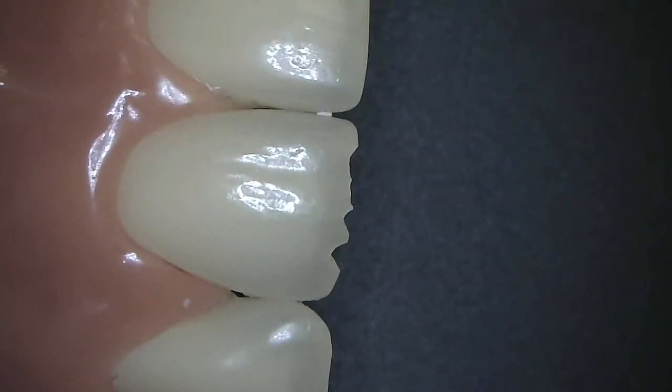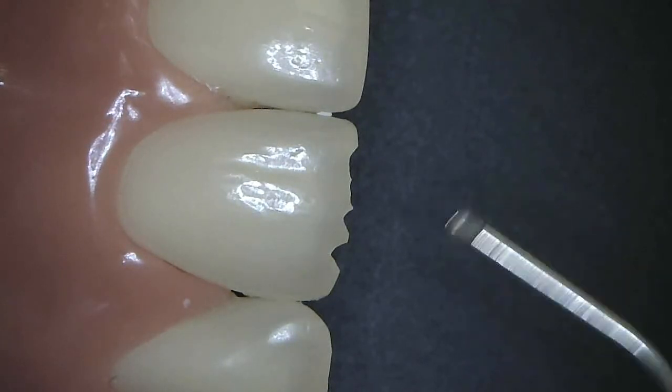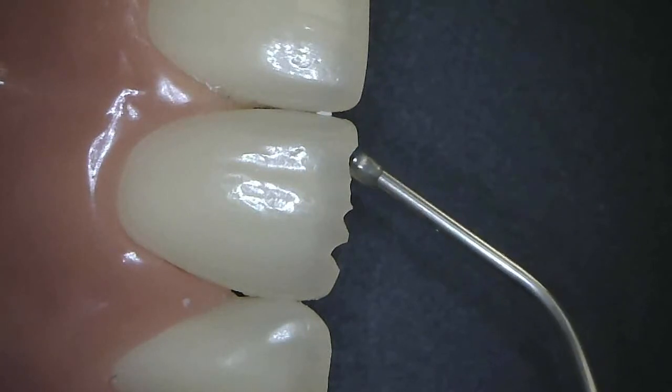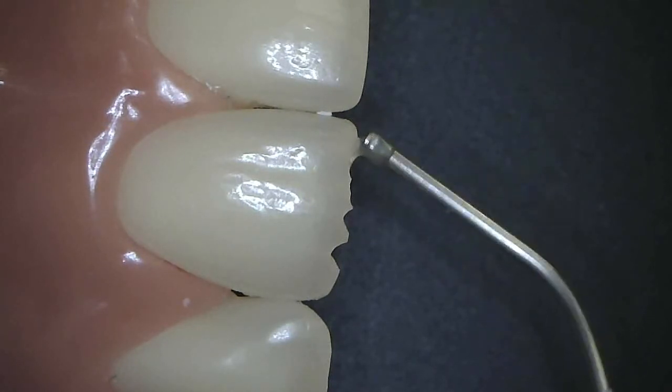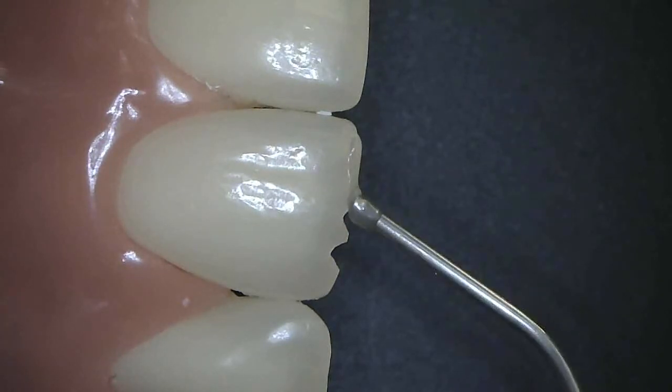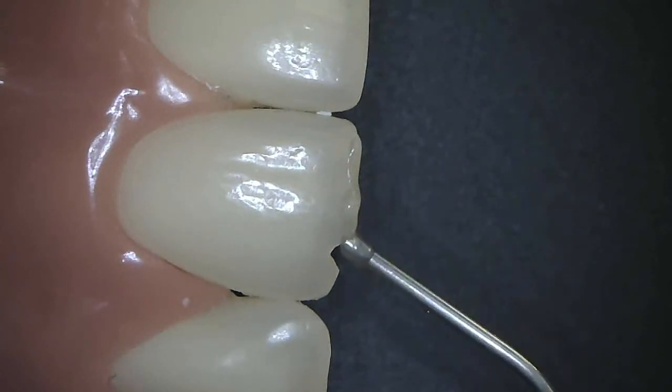Another great application for Geneal Universal Injectable is on the incisal edge. These little fractures can be restored after beveling, micro etching, acid etching, applying G-Premio bond, and then loading in material like so.